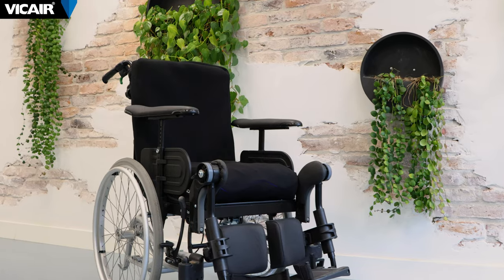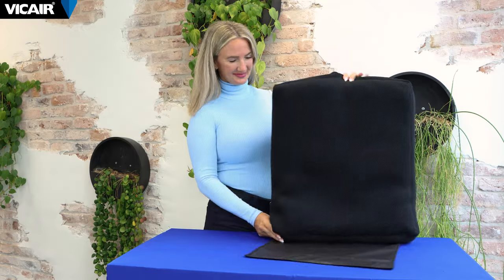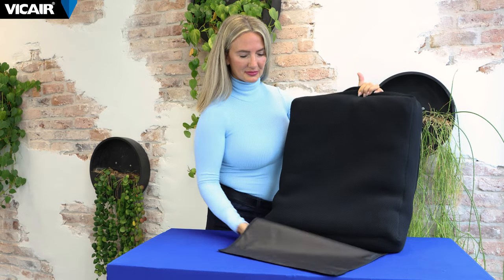This lightweight wheelchair back cushion is used in combination with the easy install Vcare strap back and can be used in wheelchairs without a back support plate. It is suitable to be used with spinal deformities and bony prominences. The anatomic back follows asymmetric body contours and keeps the client safe and stable.